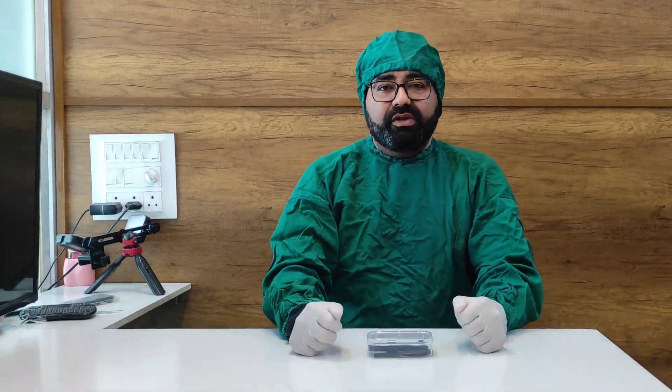Hello doctors, welcome. So in this video, I am going to explain to you and I am going to make you familiar with something called as an X-ray RVG positioner.